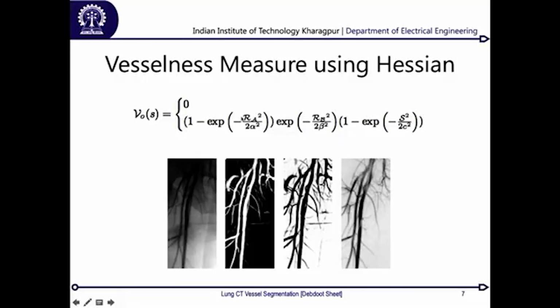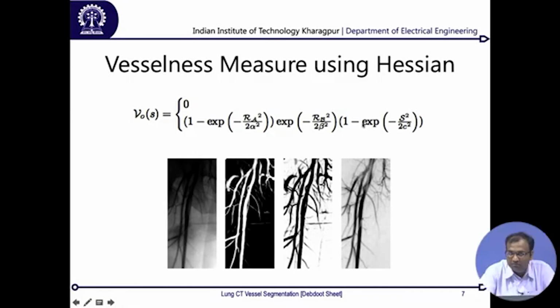Now this is a very simple technique which was not using any complicated algorithms like convex optimizations or neural networks or random forests or Bayesian belief networks. It was just a pure voxel to voxel calculation, finding the Hessian of the whole volume. For each point, from the Hessian matrix you find the 3 eigenvalues and eigenvectors.